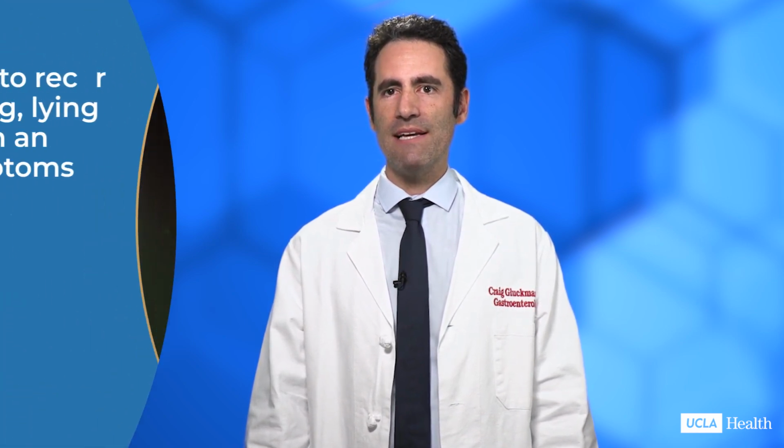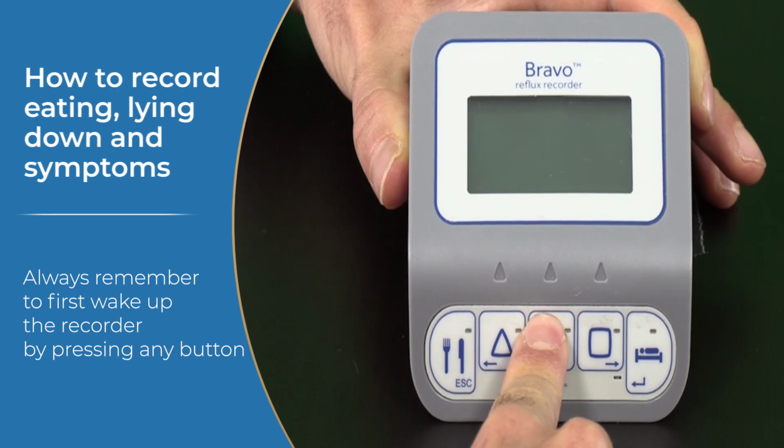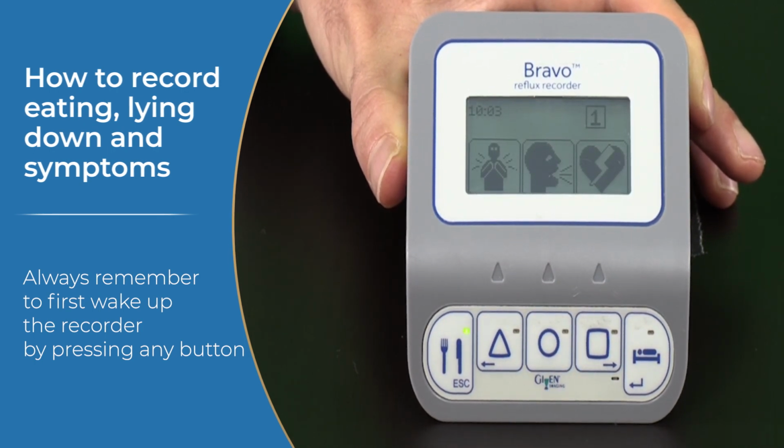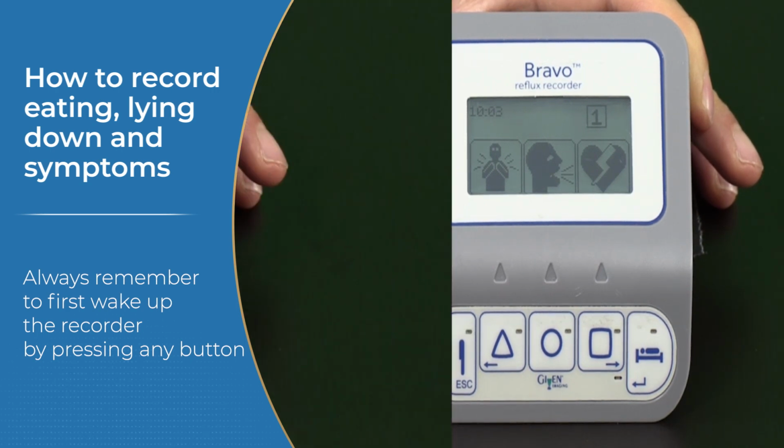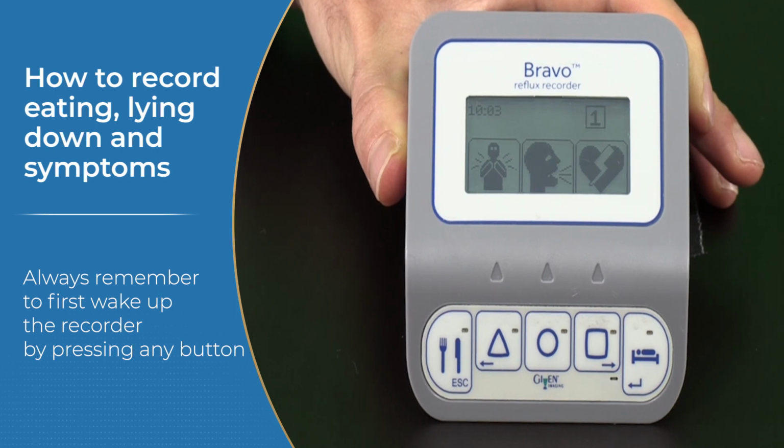Use the Bravo recorder to mark when you start a meal and end a meal. If the display is dark, wake up the recorder by pressing any button. When you start a meal, press the fork and knife button. A green light flashes. When you stop a meal, press the fork and knife button again. The green light goes off.